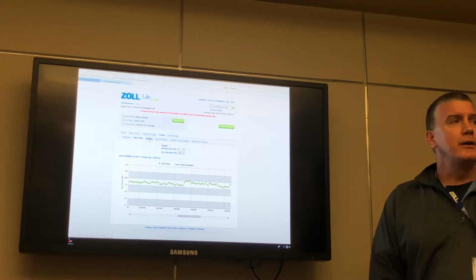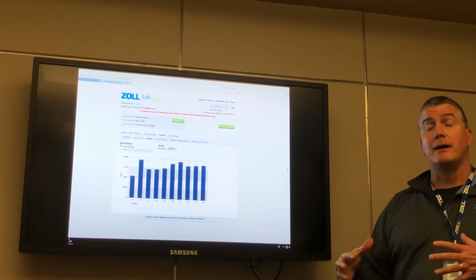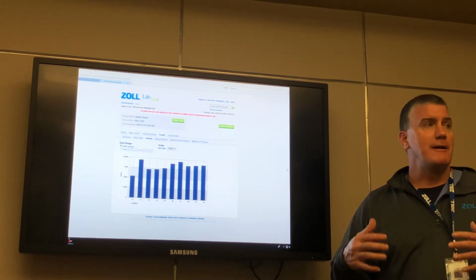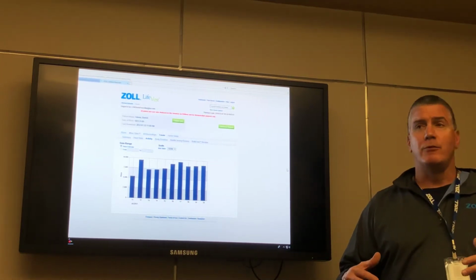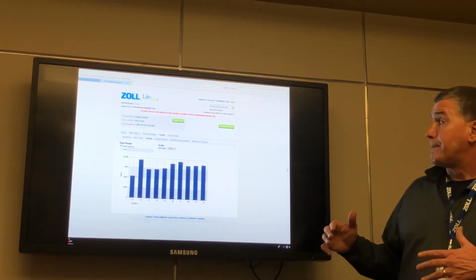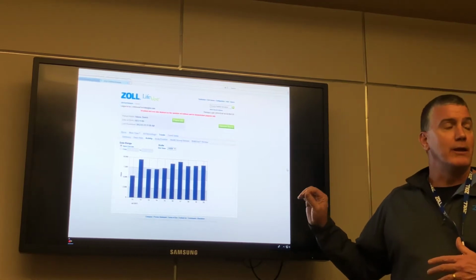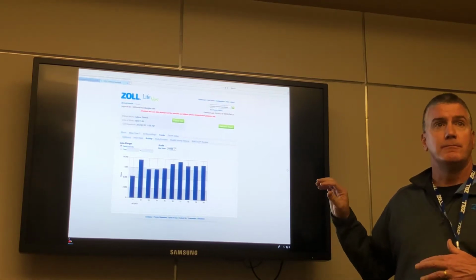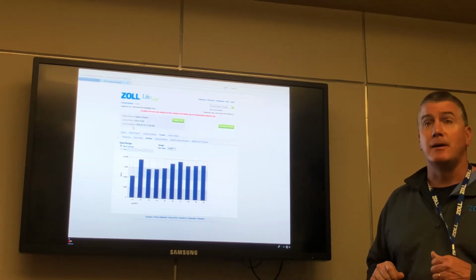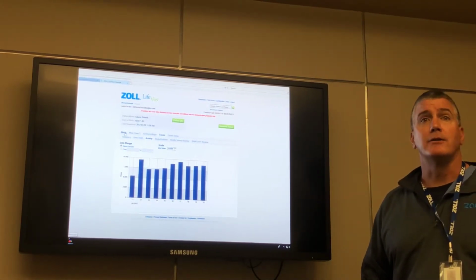So basically I just wanted to show, you know, besides being a shock box, that our primary function as LifeVest is to save lives. And we save about 3 lives as a company a day with the LifeVest. But there's a lot of other information here that could be utilized to help with patient care as we use it. So that's kind of what we're looking at here.